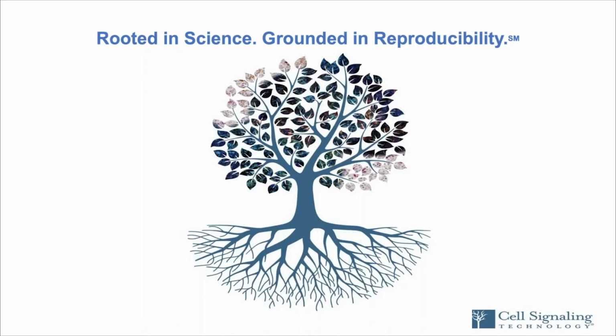But we recently came out with the alkaline phosphatase detection kit. And so that would be a good option for, like I said, using melanoma tissues. You could use the alkaline phosphatase detection with the red chromogen, and that would give you some nice contrast in certain tissue types.